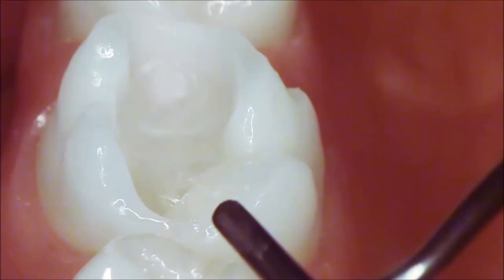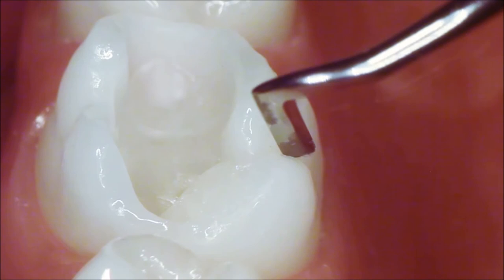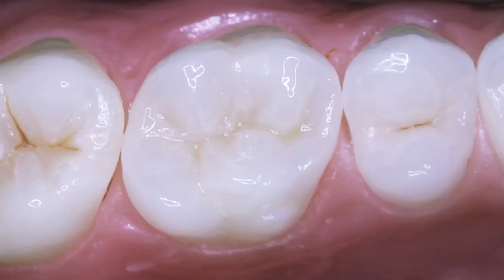Number three, the ability to sculpt the material. Four, excellent shade matching and aesthetics. And finally, number five, high polish. What's the net result? A strong, durable restoration that has high flexural strength and low wear.